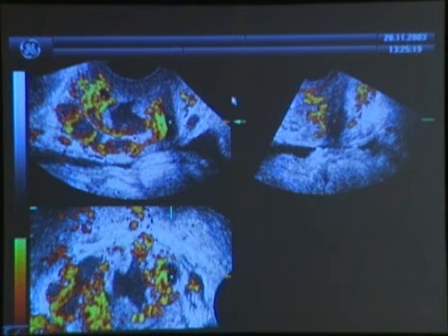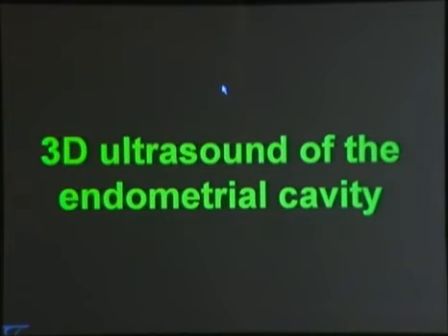Localizing a structure in the pelvis, you can see here the T shape of the bladder and the urethra. This patient had a molar pregnancy and suddenly had a little bump on the one side of the urethra that she felt with the fingers. Our gynecologist wanted to stick in a needle in order to take a biopsy. I did this 3D picture and saved her from a pretty intensive bleeding if that would have been put in.